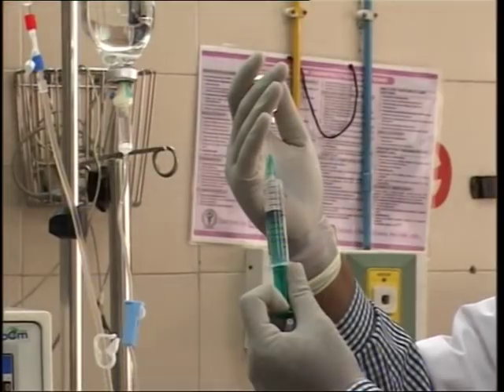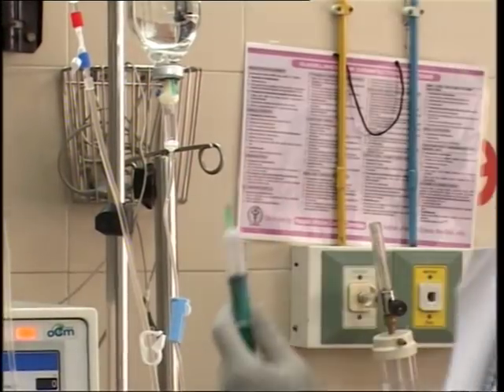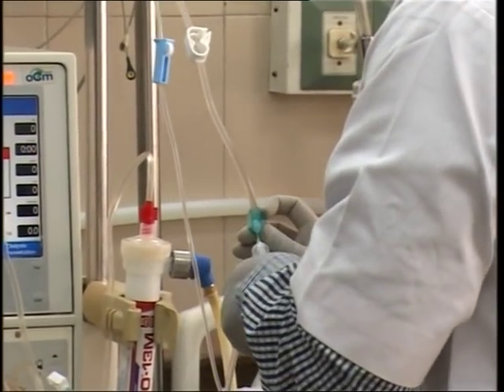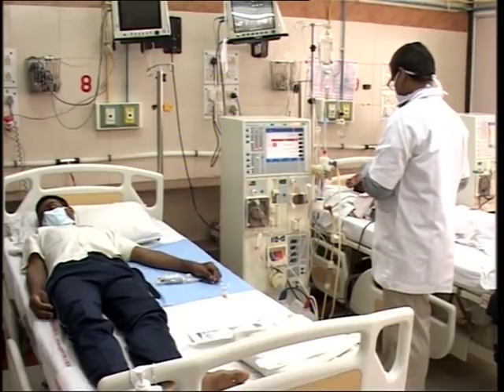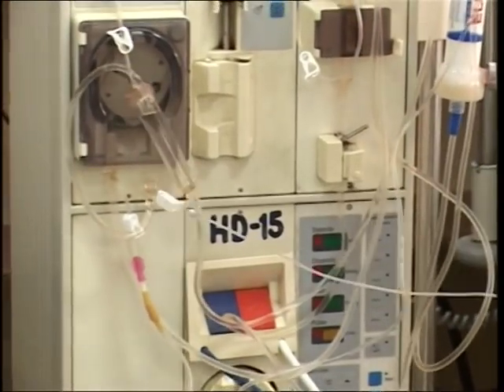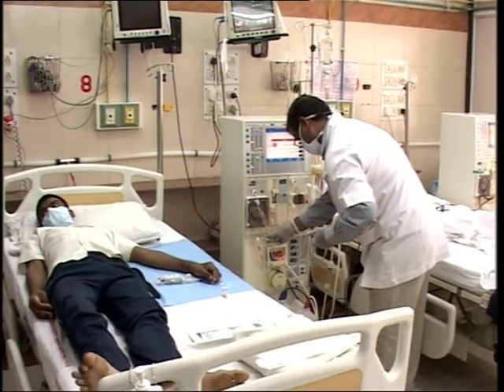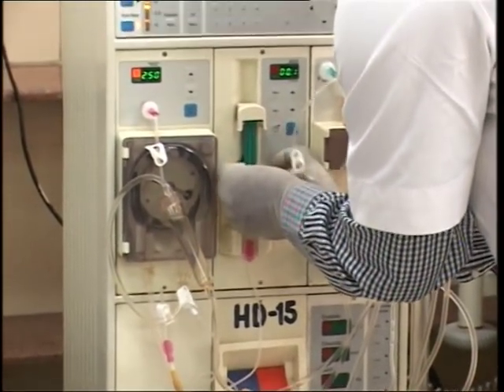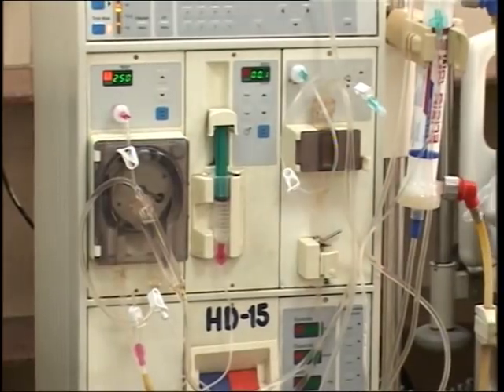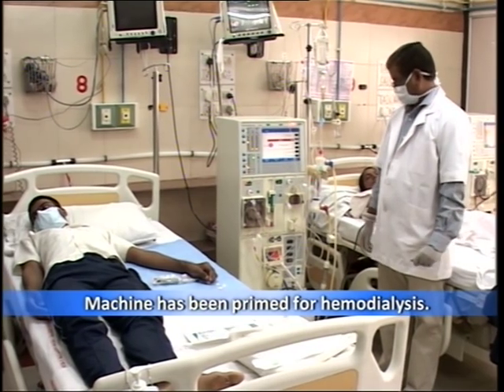Fill 10 ml of unfractionated heparin in a syringe and connect it to the respective heparin port. The machine has now been primed for hemodialysis, and we shall proceed to the cannulation of the AV fistula.